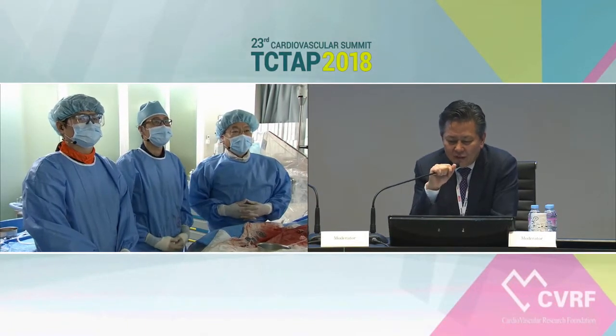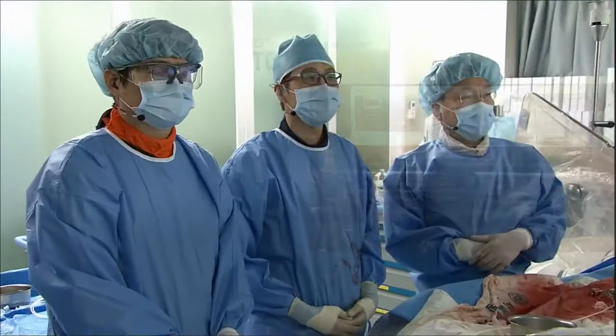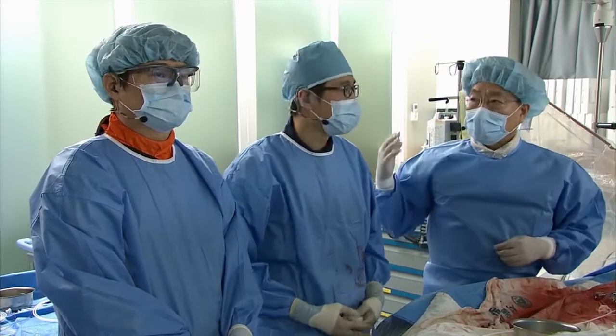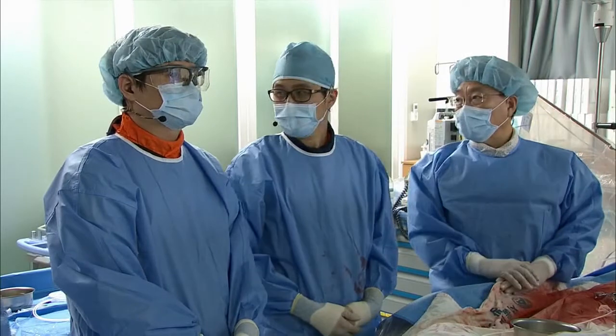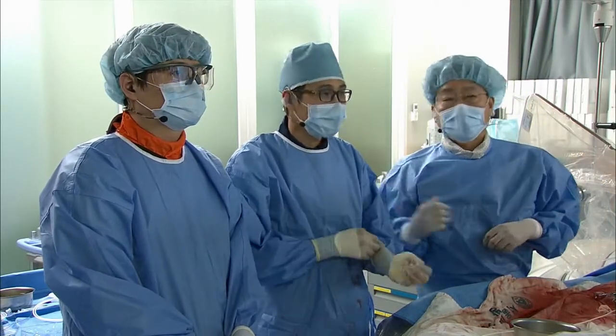Okay, would you like to start your cases? Actually, we have two cases of main PCI. All right, Dr. Cho, Dr. Hyun Lee, Dr. Jo, and our technician, Mr. Zhang here. Okay, you want to introduce the first case?